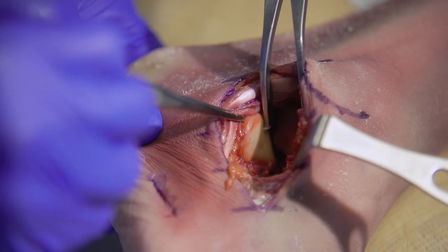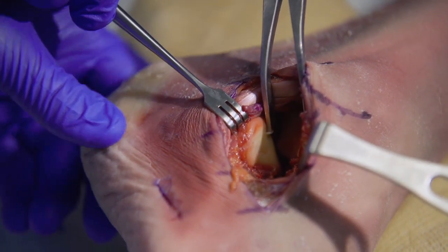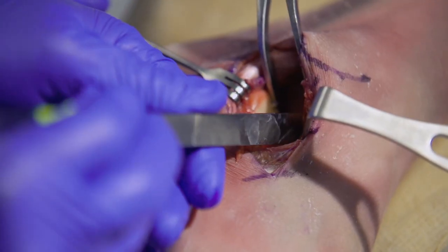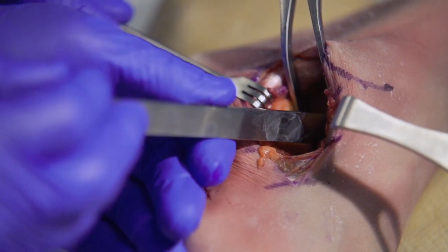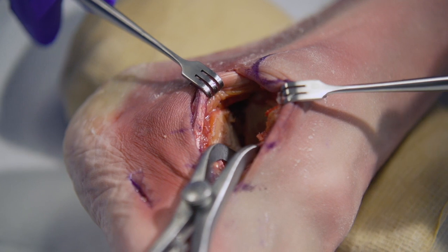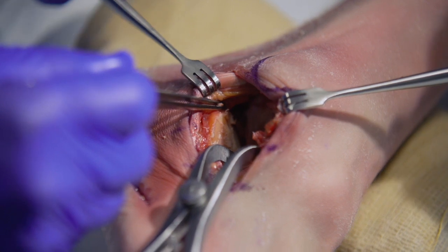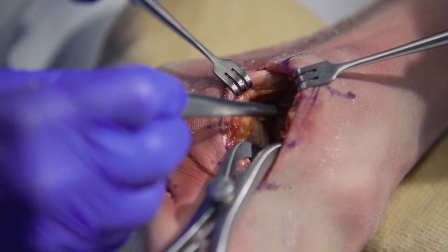At this point we are ready to prepare the middle and posterior facets for arthrodesis. This is done using curettes or osteotomes to remove the cartilage down to the subchondral bone plate. All four facets are prepared: the posterior facet on the talus, the middle facet on the talus, and the posterior and middle facets on the calcaneus. The posterior facet of the talus and the posterior facet of the calcaneus have been denuded of articular cartilage.